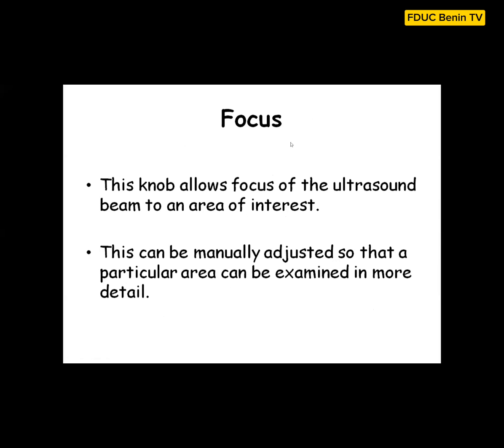Another knob that we commonly use too is the focus. You use the focus to pay attention to a particular area of your study. This knob allows you to focus the ultrasound beam to the area of interest.